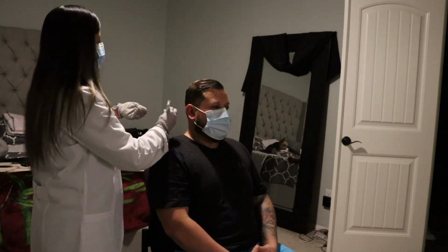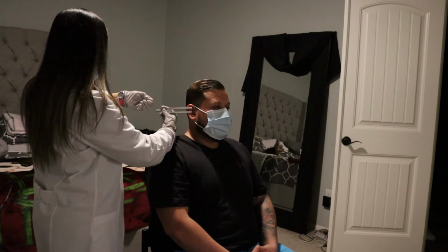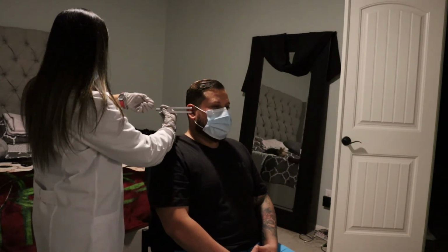I can no longer hear the vibration. I can no longer hear the vibration.